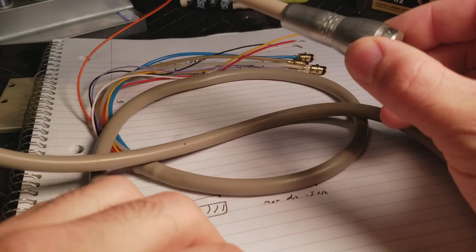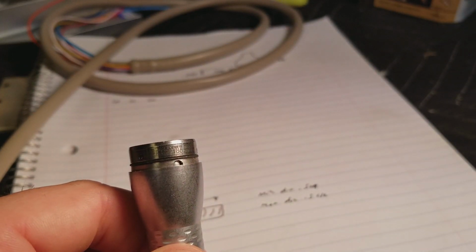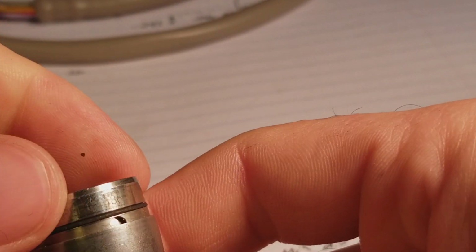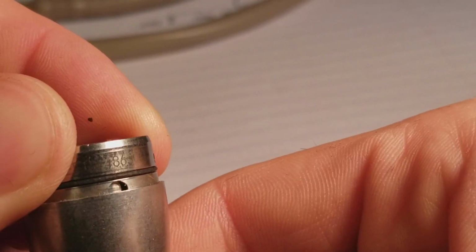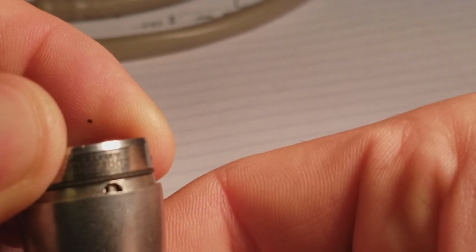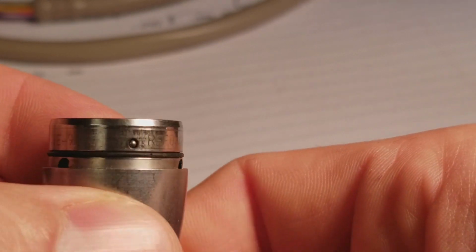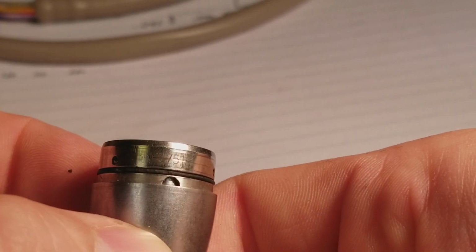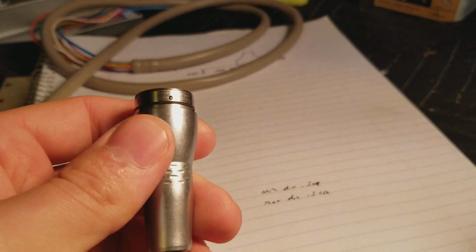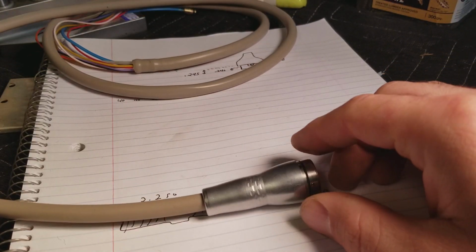So what I did is I looked into this quite a bit, and upon closer inspection, let me zoom in here and see if you guys can see this. You'll see that actually when you're spinning this around, see that little window that's right there? Come on, focus. That window there, did you see that little circle go by right there? There's an inside piece that's spinning with this outside piece. And there's also 3 of these windows on the VE-9 cable. Well, that's the secret to opening up this piece so we can get them to separate, so that we can get access to the rest of the wires.